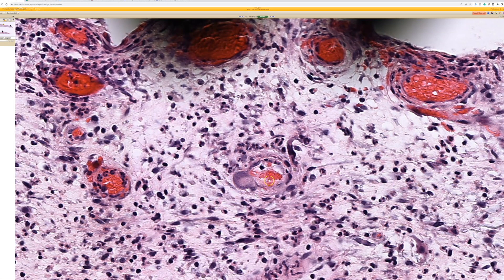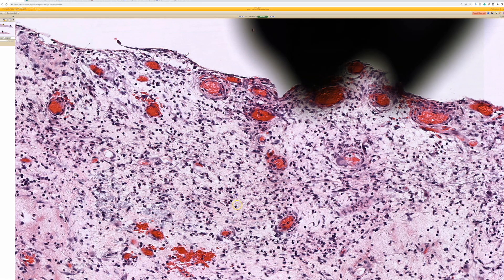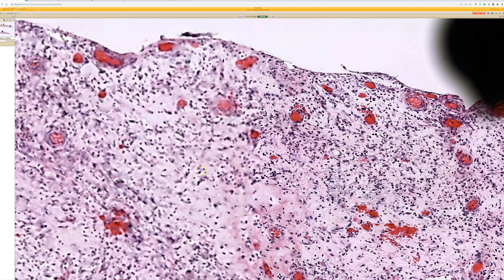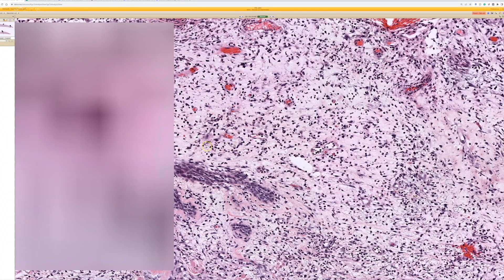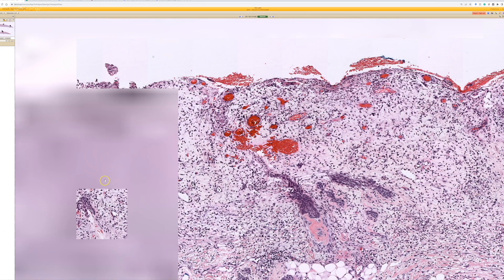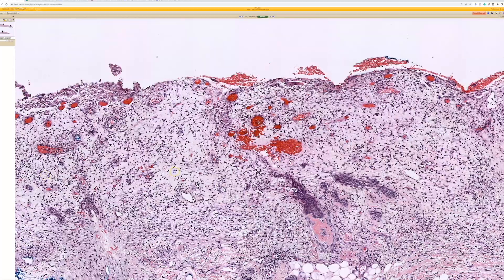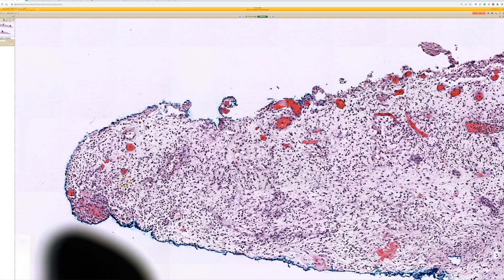You can use the CMV immunostain to confirm those are CMV if there's any doubt. They can occasionally infect other cell types, but the most likely cell type is the endothelial cell, so spend time looking around the vessels. If in doubt, you can add on an immunostain for CMV — cytomegalovirus, which is a member of the human herpes virus family, just like Epstein-Barr, HSV, and VZV; they're all related in that same family.